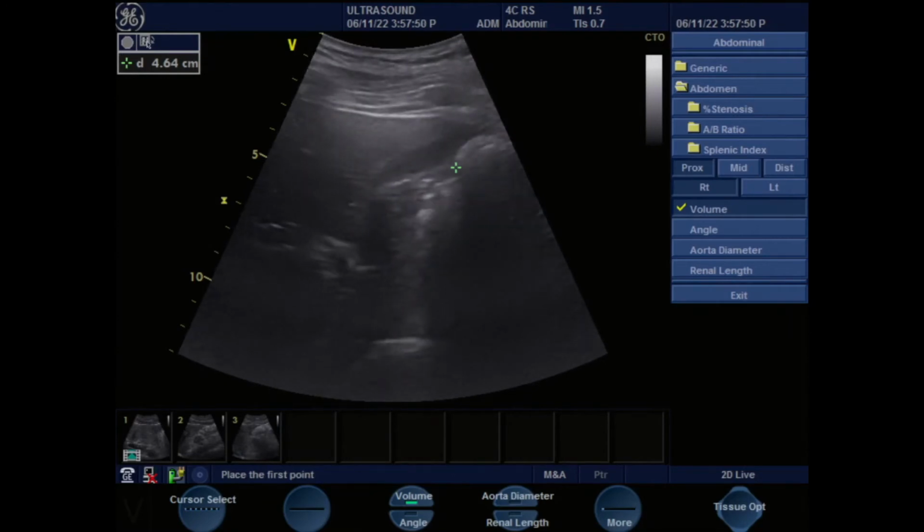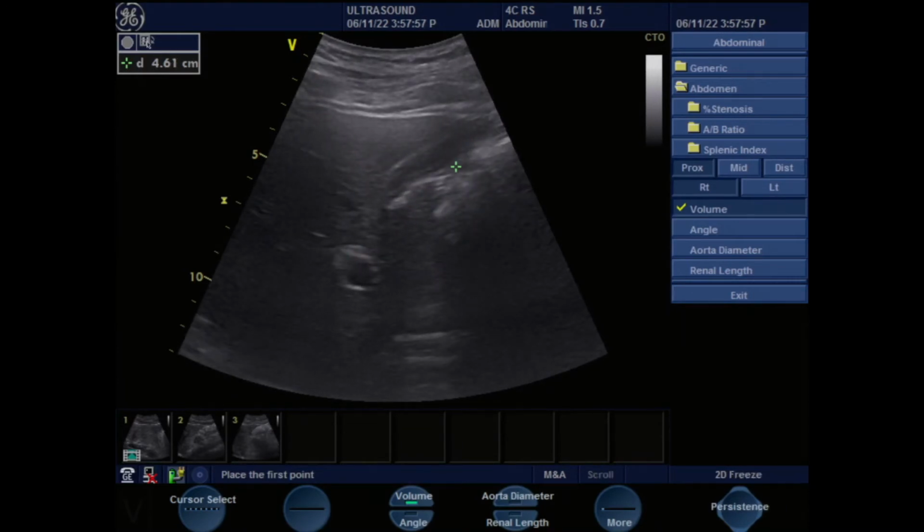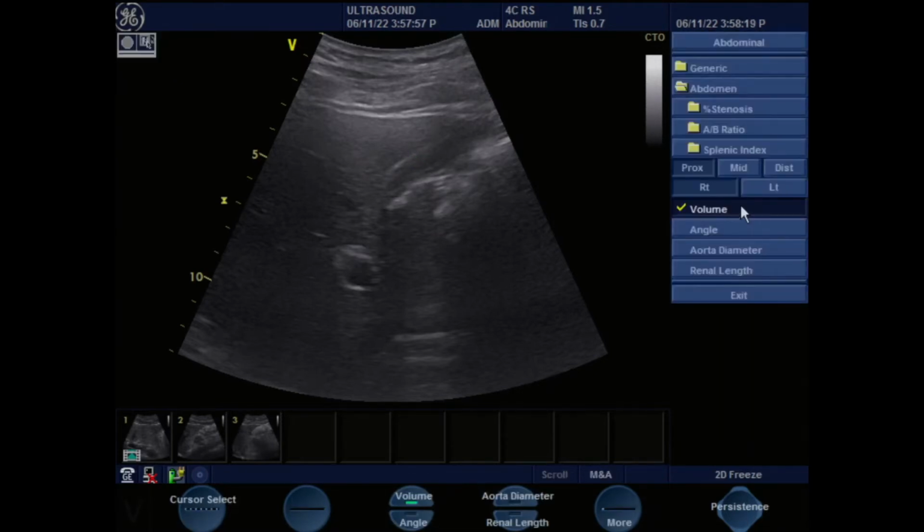It's a little bright there because it's not projecting nicely on this window. So here, you see this double line, this line inside? This bright line outside is the wall, and this line inside is just the contracted lumen. So there was wall thickening, you could see that. So we cannot say on this image, if I were to measure, where's this thing? Oh, this is beautiful now.